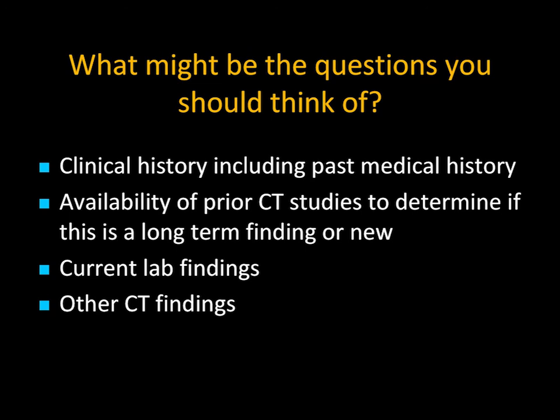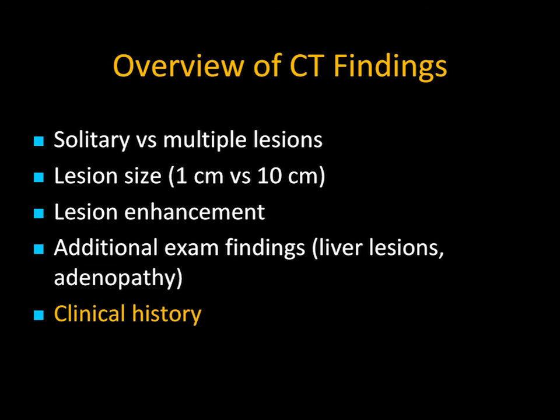But when I look at a splenic lesion, history is critical. Does the patient have lymphoma? Are there other organs involved? Are the lab tests abnormal? Are there other CT findings?